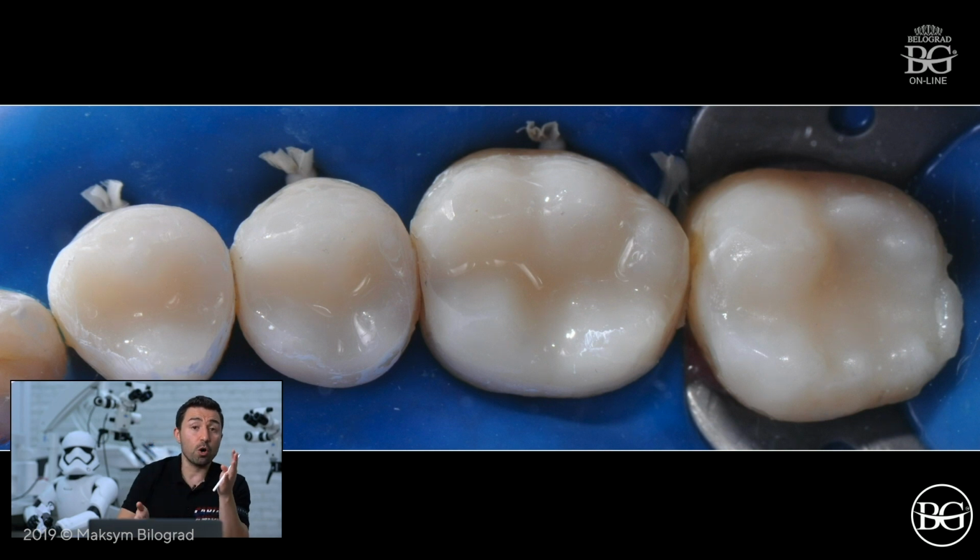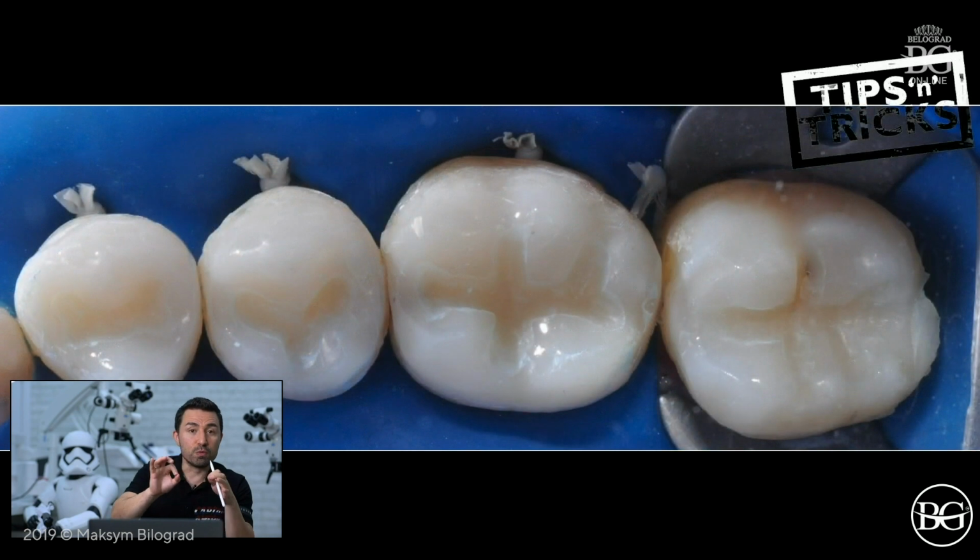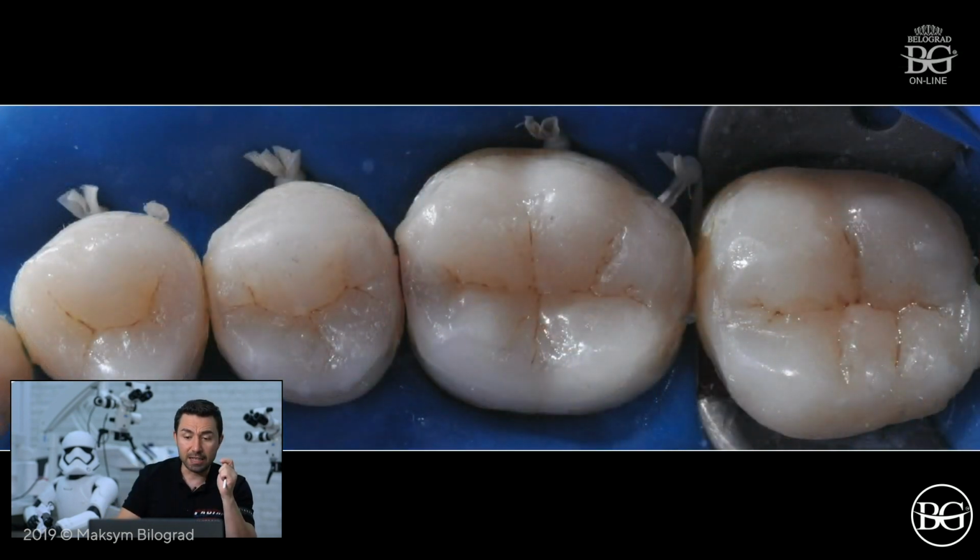If I had known the trick, because at that time I didn't know that I can reline it with a transparent silicone, because silicone is soft and it can reflect a lot of details. In this case, I did 2 steps actually. I made some small room within this composite, and then I did a freehand layering technique.